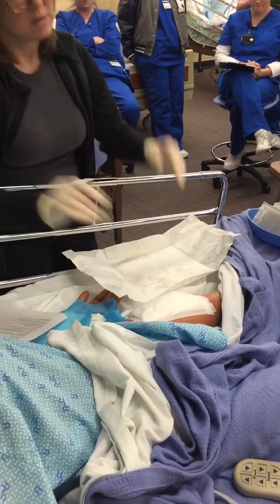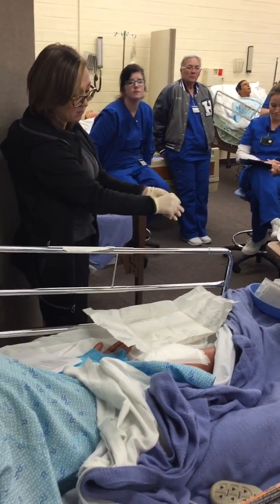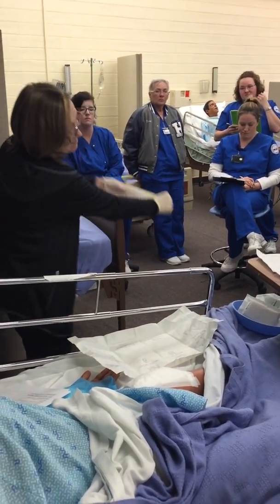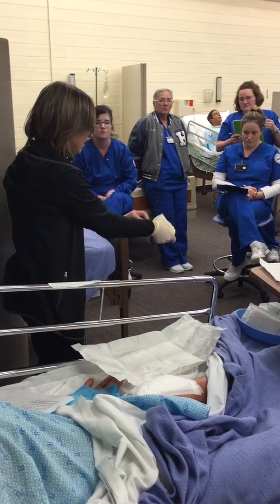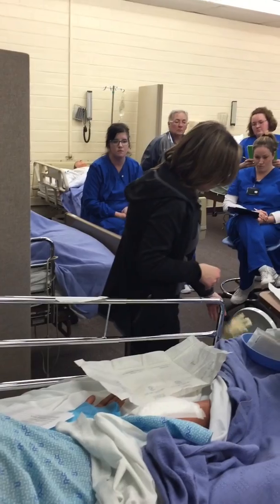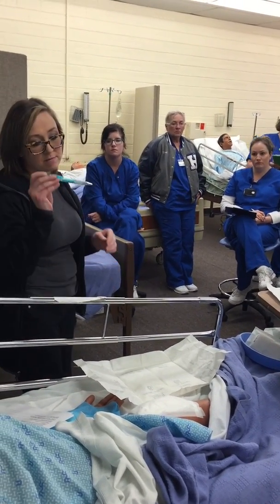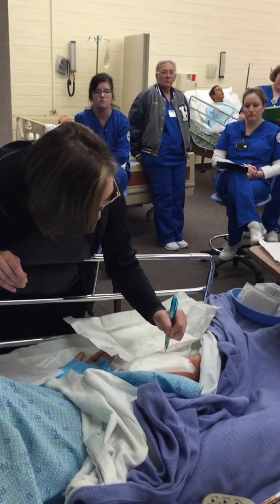There you go. And then you can take your gloves off just like you would take your normal gloves off. These are really sticking today. So I'm going to take those off and get rid of those in the trash can. And then you would have a pen on you, like I do right here. Okay. And I'm going to go right here.